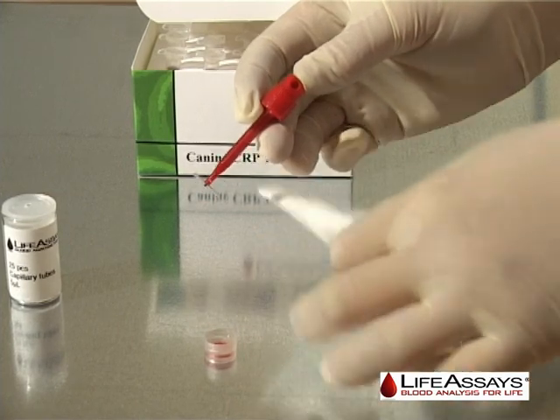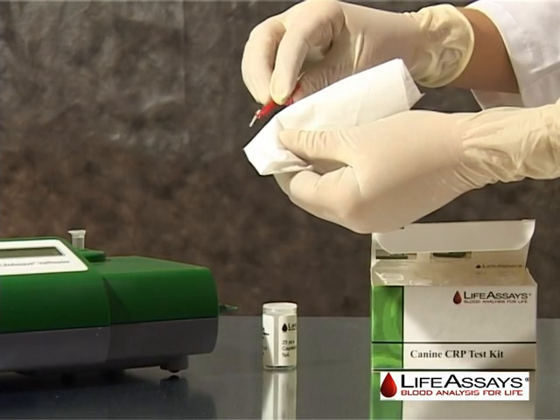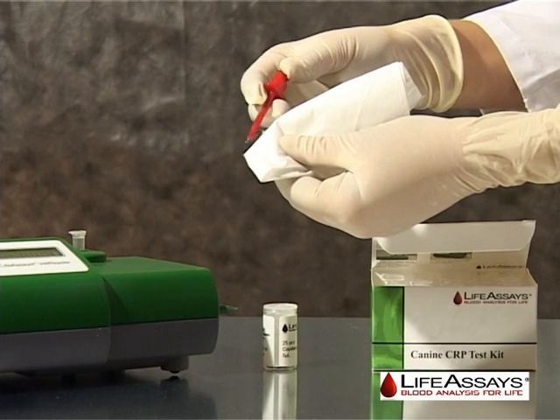Excess sample on the outside of the capillary can be removed by carefully wiping off the excess with a clean tissue.